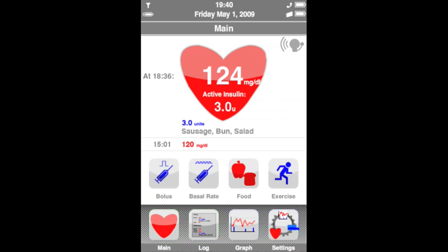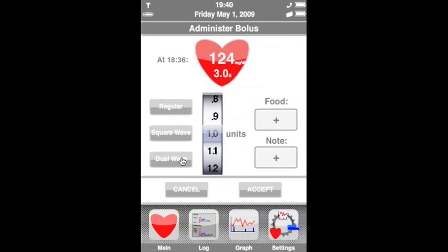LifeApp connects wirelessly with the user's insulin pump, allowing them to administer boluses, set basal rates, and adjust pump settings from their phone. Since the pump no longer needs its own interface, it can be made smaller, lighter, and less obtrusive.